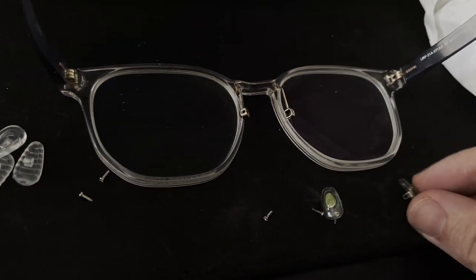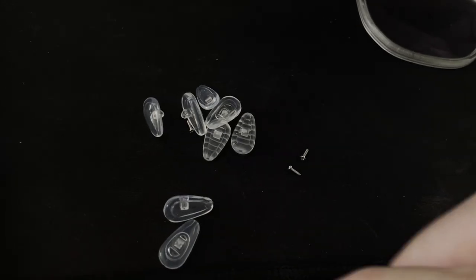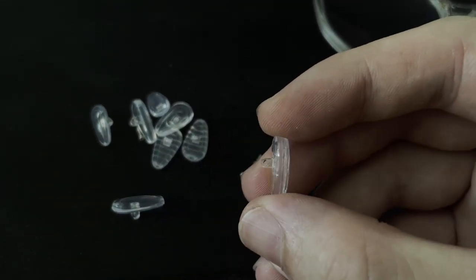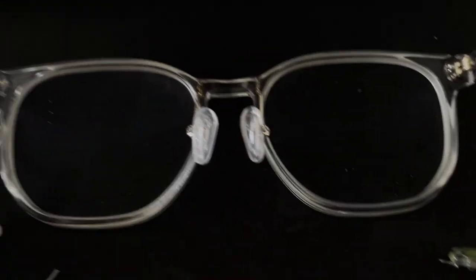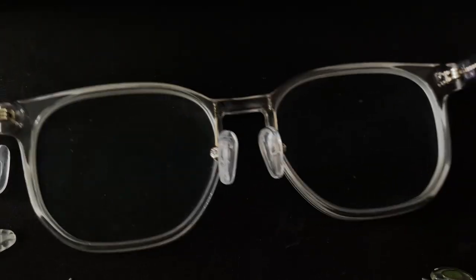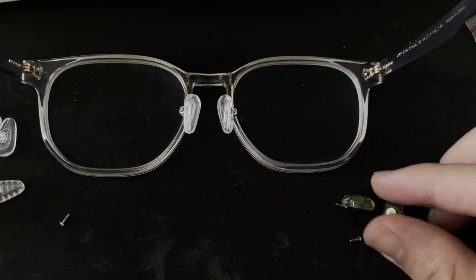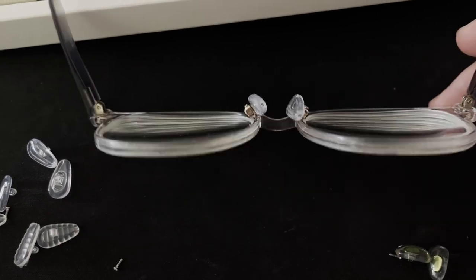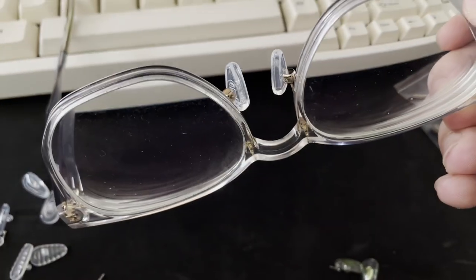So what I did was I bought a bunch of these plastic transparent nose pads. You can get these from Amazon or anywhere for really cheap — you can get a whole pack of them. There's no metal inside them, which is great. Now that I've changed these to the transparent ones, hopefully this will solve the problem with nose pads turning green. Hope this helps!